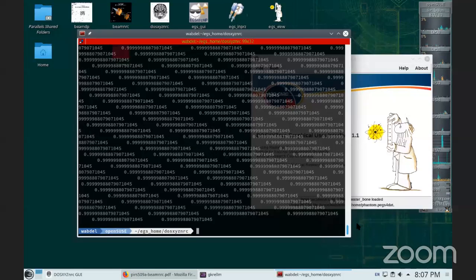Are you planning to show us a CT phantom in the future? I haven't done it before, but I can arrange to do it. So we will see with Bilal; we can create an anonymous patient. You need to anonymize the patient, and let's see if we can create those XYZ from CT.